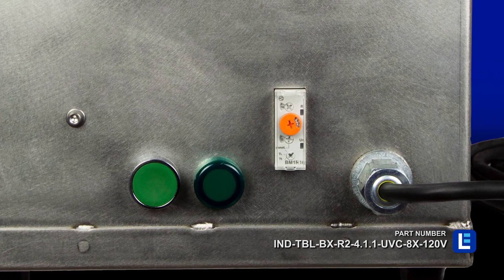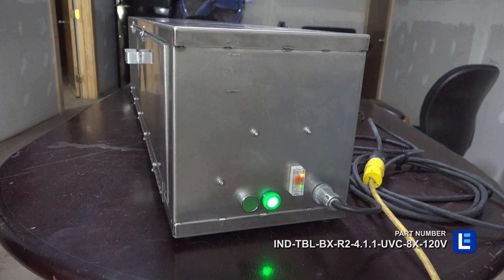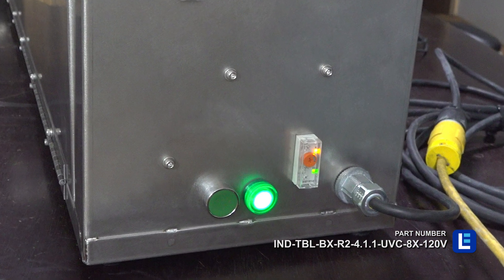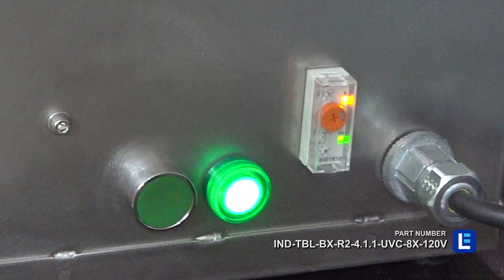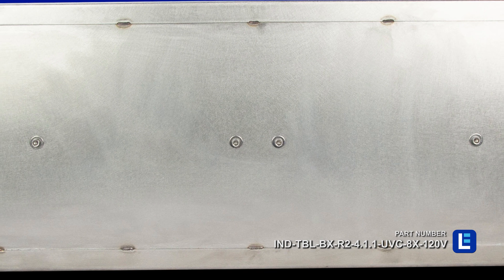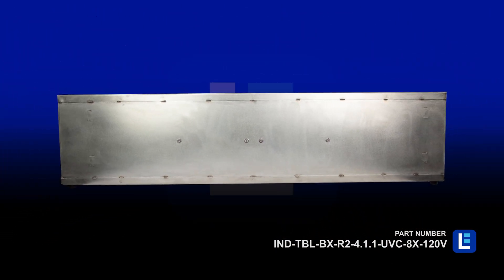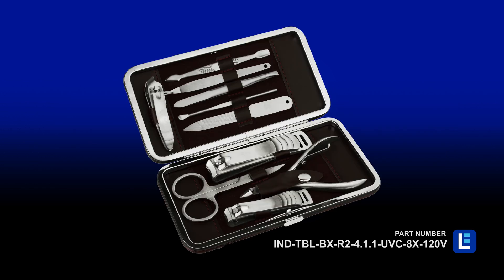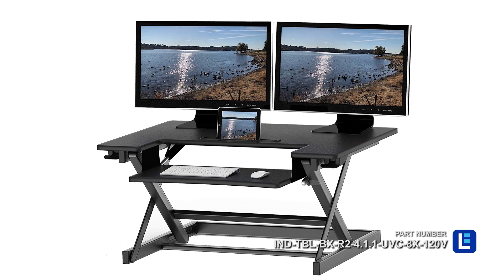Operators may access a timer on the box to ensure the recommended duration of exposure is met every session. An external indicator light notifies individuals when the box is on and sanitation is ongoing. This system is constructed of 304 stainless steel for durability. This device is recommended for disinfecting compact tools and equipment on tables, desks, workstations, and surfaces.